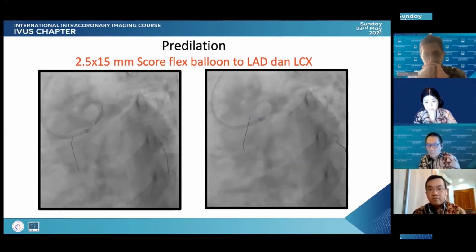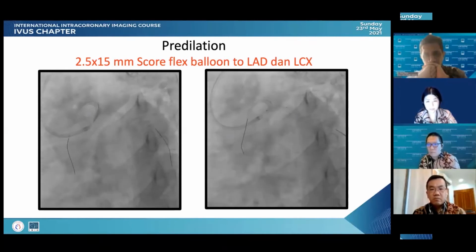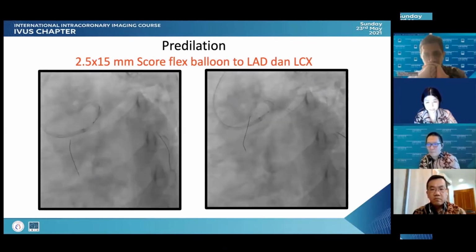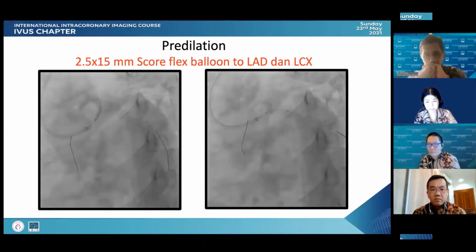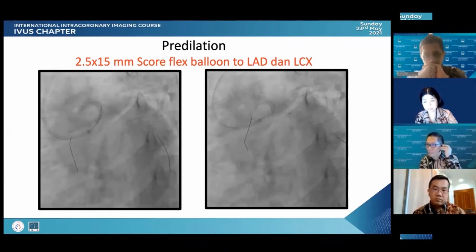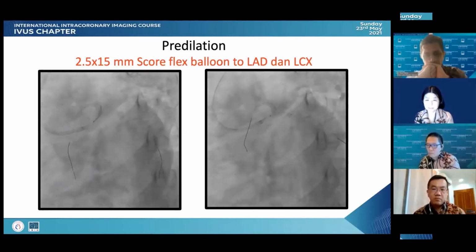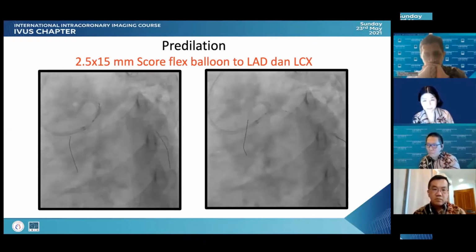By the way, we published a paper on rotablation with or without a cutting balloon or scoring balloon. Is it better compared to the regular balloon? We see it is better, like a synergy effect: you have the rotablation, then you polish the surface, and then you do the scoring or cutting balloon. We see more fracture afterwards, based on serial OCT or IVUS pictures.